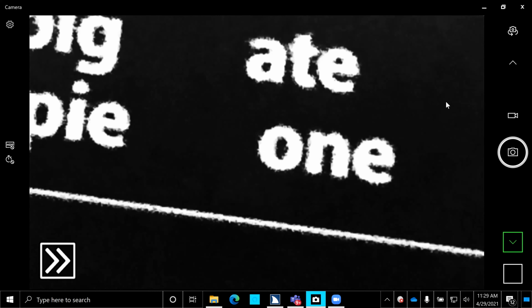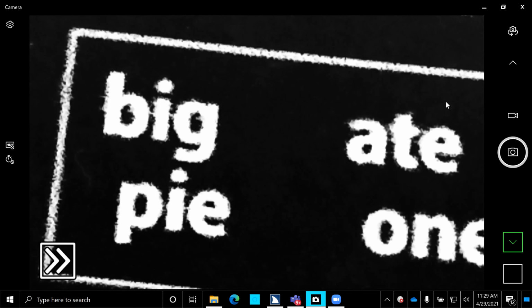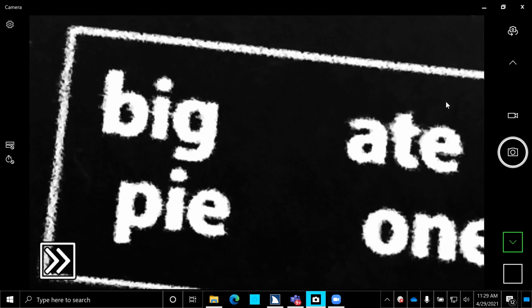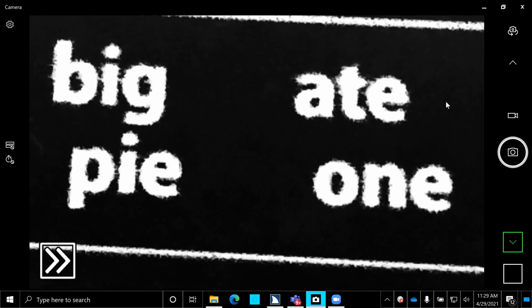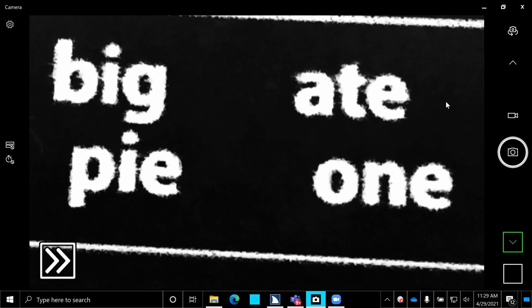So I just right now have the Juno in, I've deployed the stand, which Justine will get into in just a second about what the stand is, but the stand is built in. And this is the standard reading view that it defaults to. So as Justine mentioned, when the stand is deployed, no matter if I've got it in self view, I've rotated the barrel camera, let's just say 180 degrees, and I'm looking at myself, if I deploy the stand, it always defaults to the reading view immediately. You'll feel that camera immediately flip to get you back into the right view.